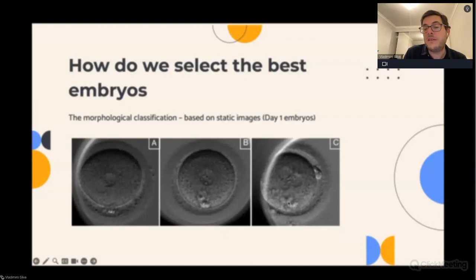So this is an embryo at risk. It's a triploid embryo. This one here, I believe, just has 1 pronucleus. We would need to take a better look, but in principle that's it, and so these two would in principle be excluded from the culture. There are some recent studies that indicate that some of these embryos can be normal, but we have other technologies to assess that.